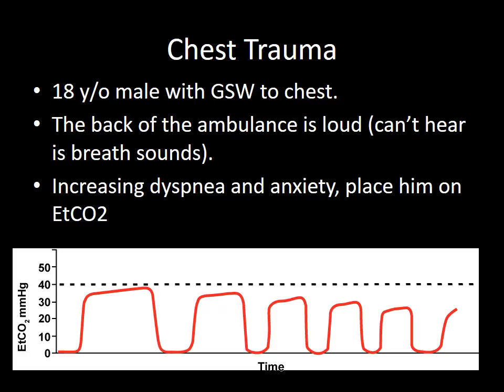Another scenario, let's use this in a trauma case. So we have an 18-year-old with a gunshot to the chest. The great thing about capnography is if you're in an environment that you can't hear very well, like the ambulance or helicopter, you're not going to be able to hear the breath sounds, or at least not very well. So that's why capnography is going to be such a great tool to augment your clinical assessment, because you can monitor their ventilation, you can monitor their perfusion.